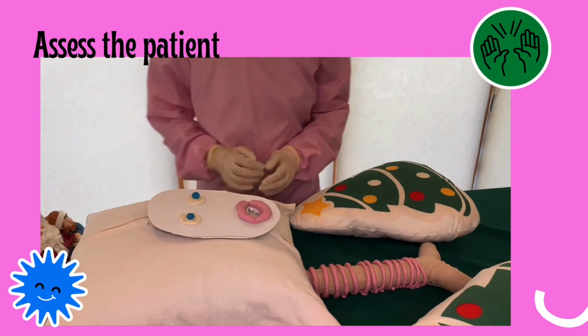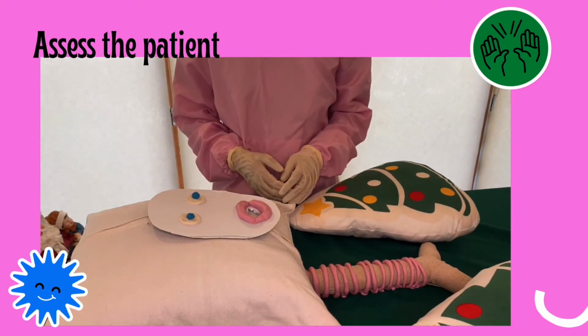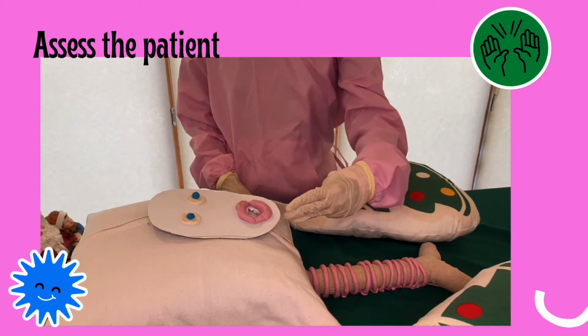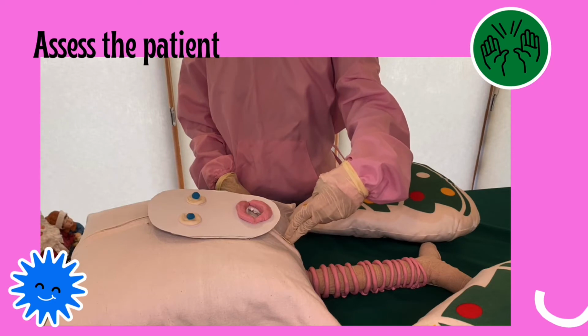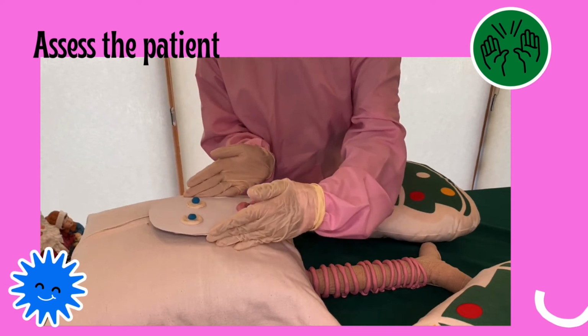Assess the patient for possible difficulty in intubation. Mnemonic LEMON. First, look externally for any trauma of the head and the neck. Then, the 3-3-2 rule: the distance between the upper and lower incisors, the distance between the hyoid bone and the chin, and the distance from the thyroid cartilage to the floor of the mouth. This is to evaluate the Mallampati score, obstructions, and neck mobility.